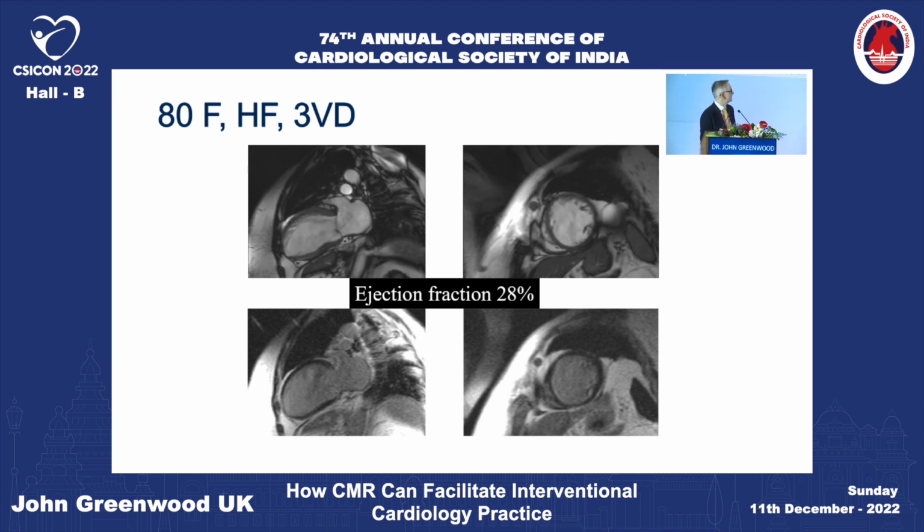This is an 80-year-old female admitted with heart failure. You can see the ventricle is pretty shocking on the cine images, long axis view here, the anterior wall, inferior wall, not very dynamic. Same on the short axis view. And if you look at the myocardium, it's all nice and black. So there's a little bit of white subendocardially, but generally black is viable, white is dead. You can see she's got lots and lots of viable myocardium.